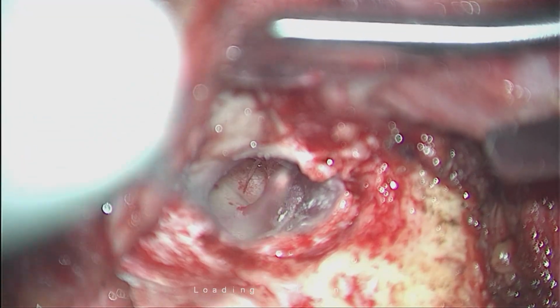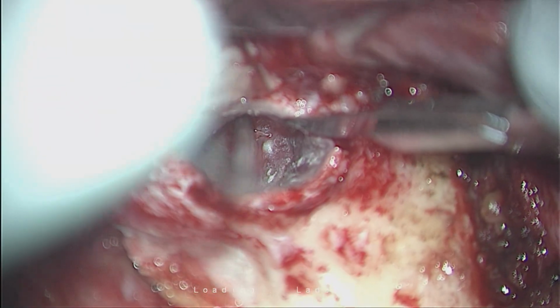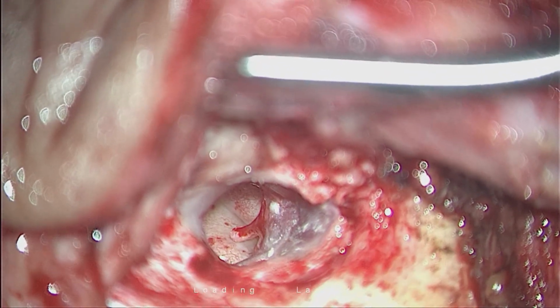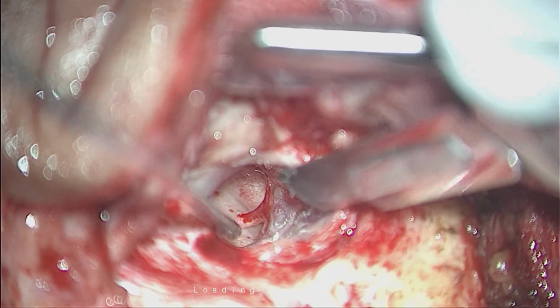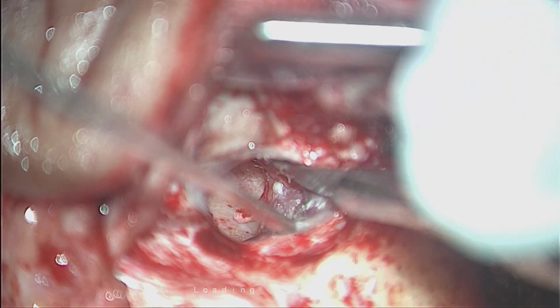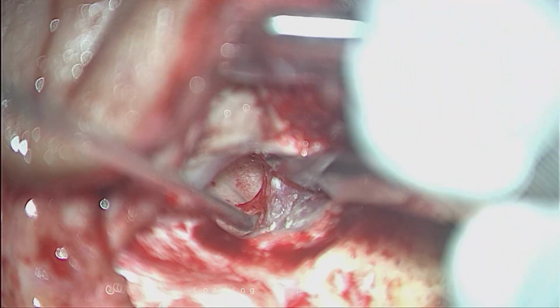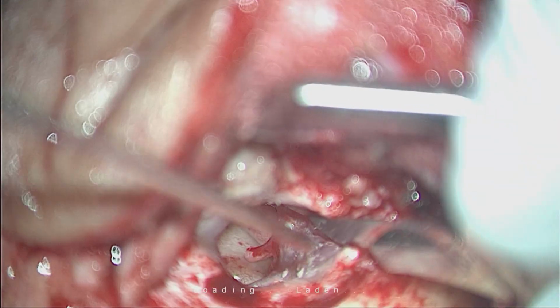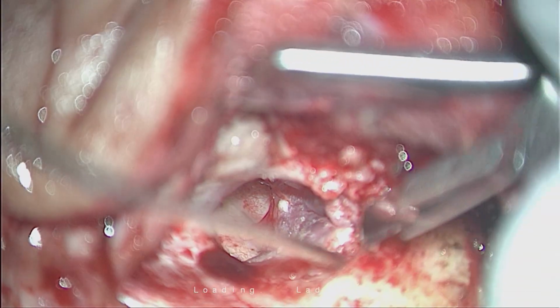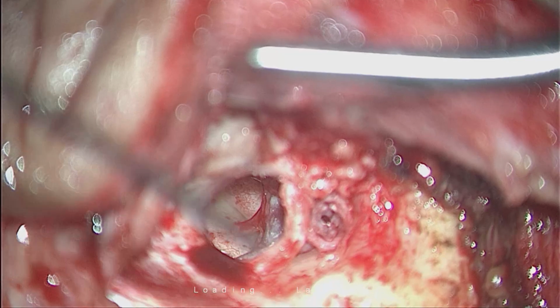And this should be almost 360-degree elevation, because we have to go all around this perforation and beyond for additional tucking of our graft. So this is the posterior superior margin of the perforation. Can you see? My incision is a few millimeters beyond this posterior superior margin. This canal incision, a few millimeters beyond the posterior superior margin, you can see.